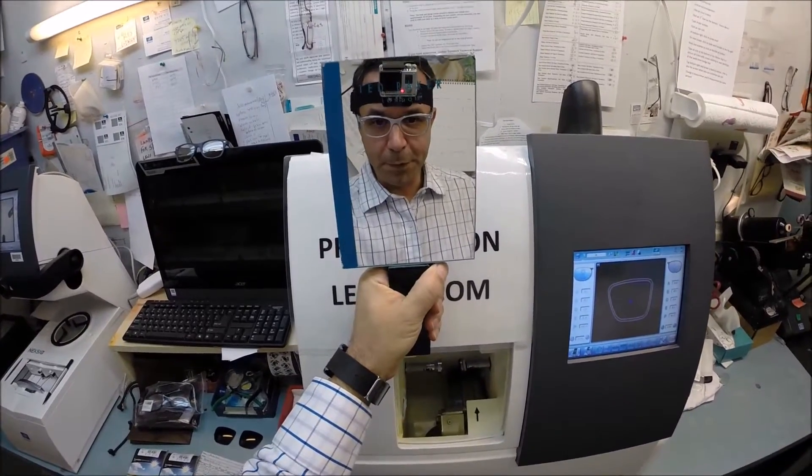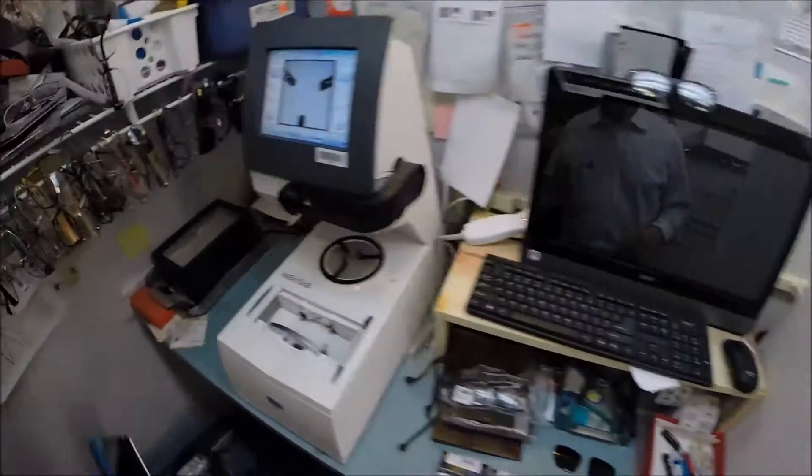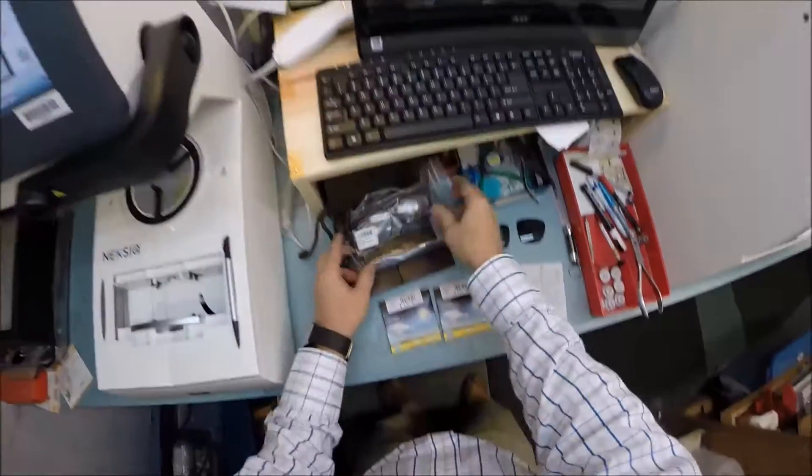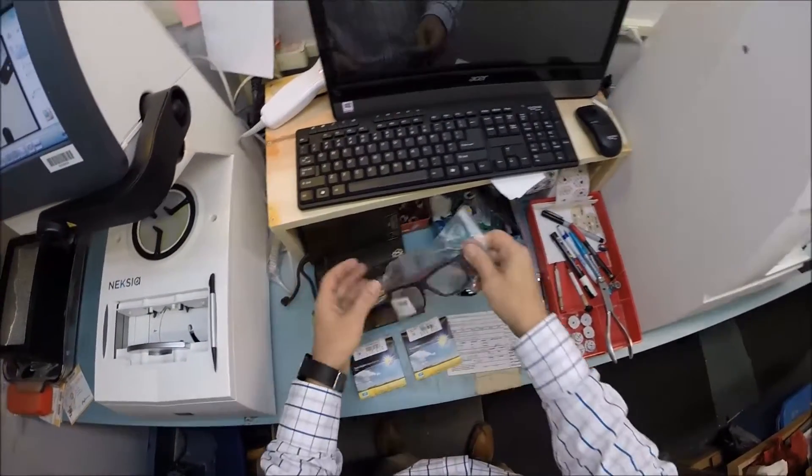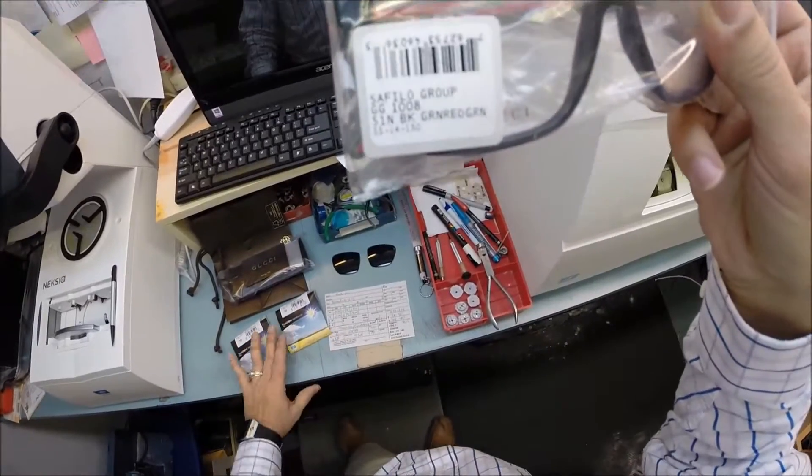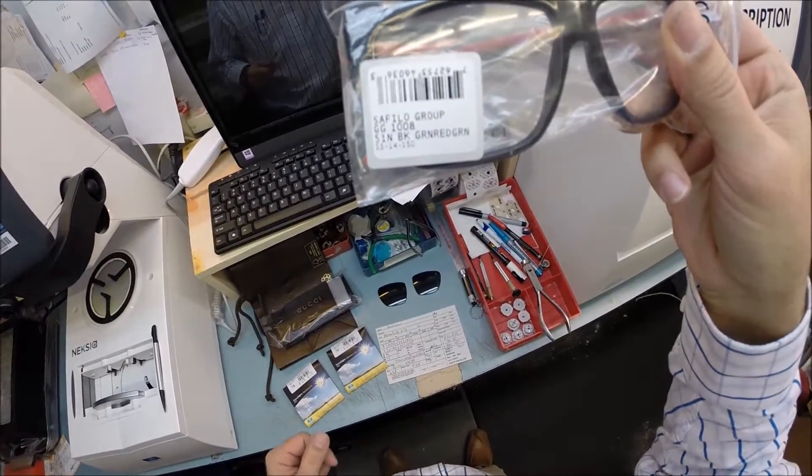Hey Andrew in Bloomfield, New Jersey. Matthew here with freeprescriptionlenses.com and with the help of my GoPro camera, I'm gonna show you how I cut prescription lenses with Transition 7 gray lenses and Crizal Alize for your new Gucci 1008, size 55, in the color 5-1-N.